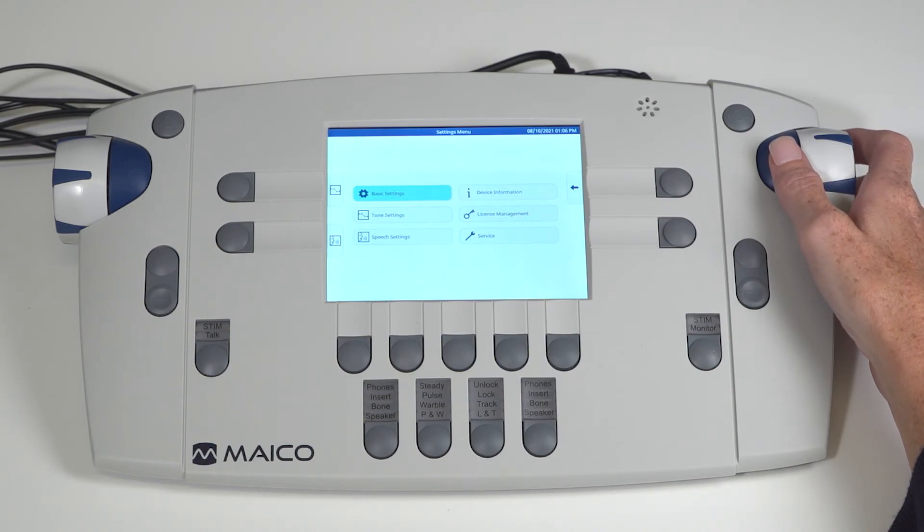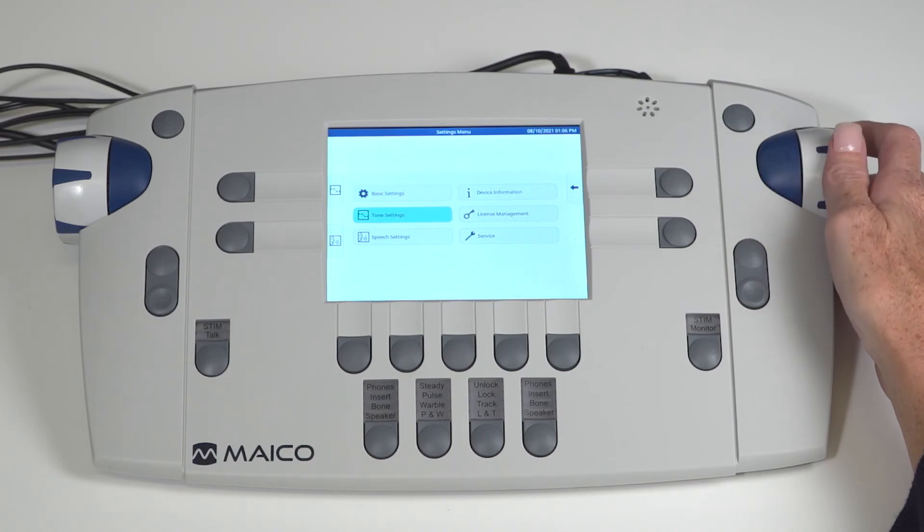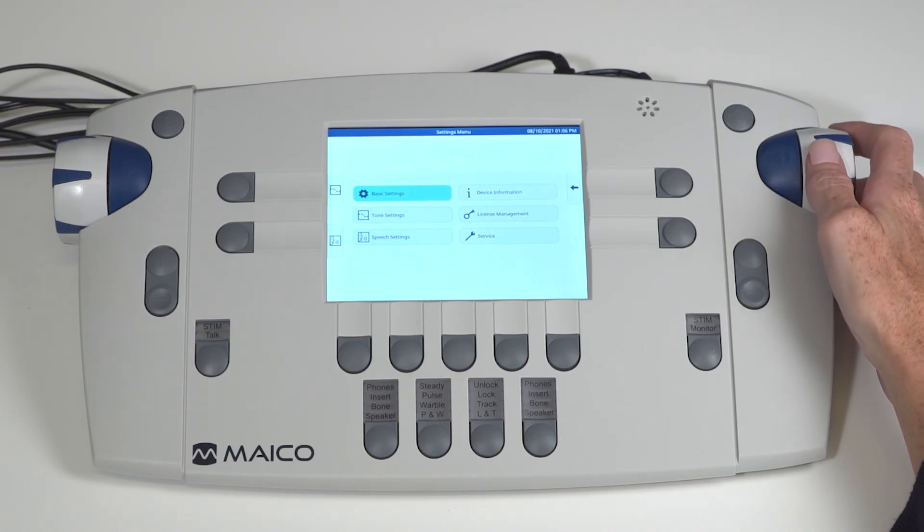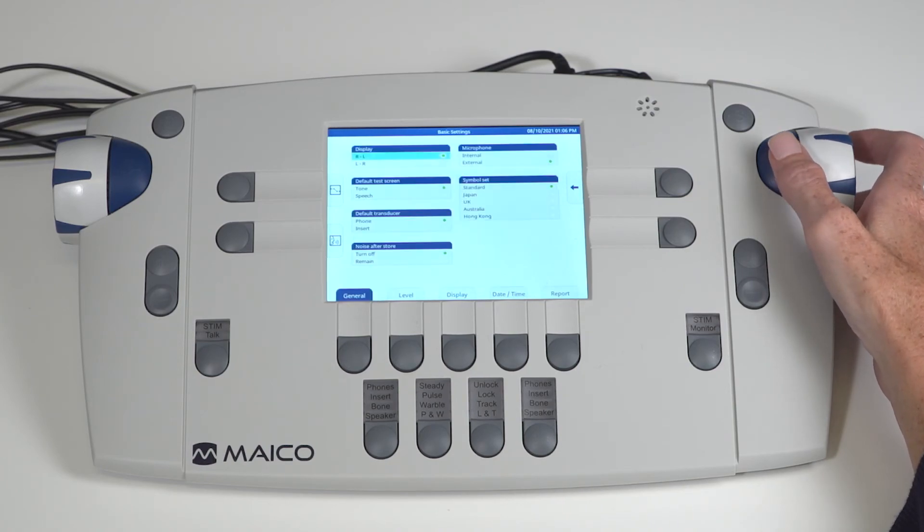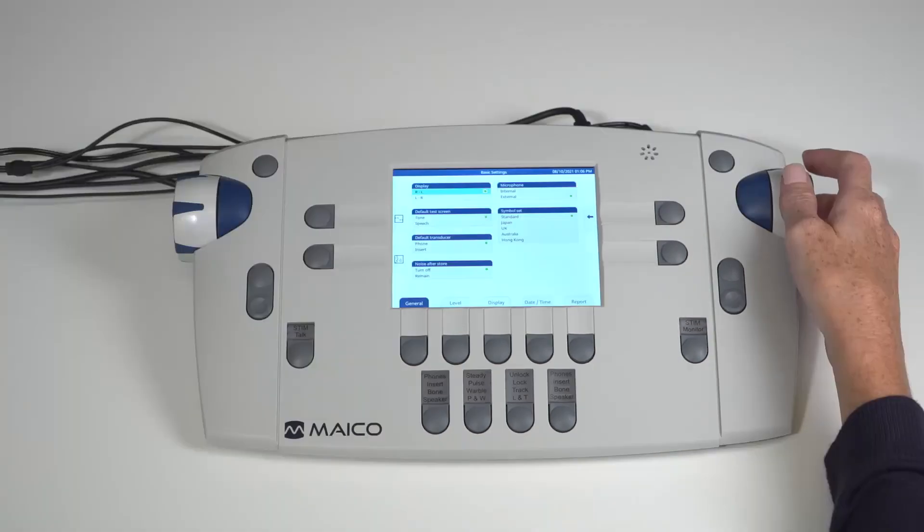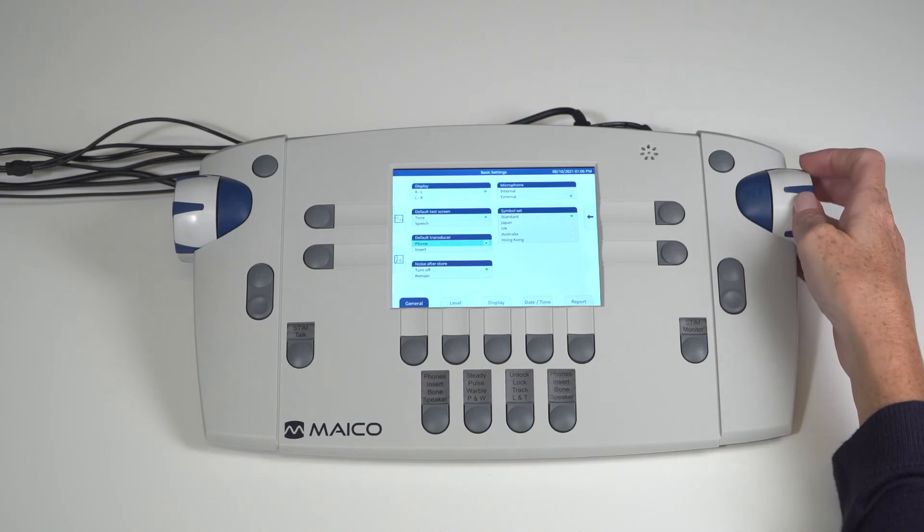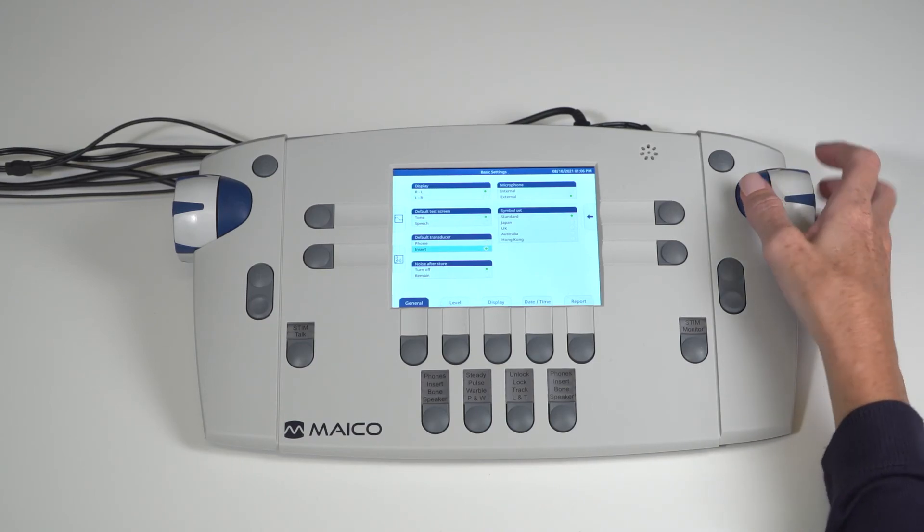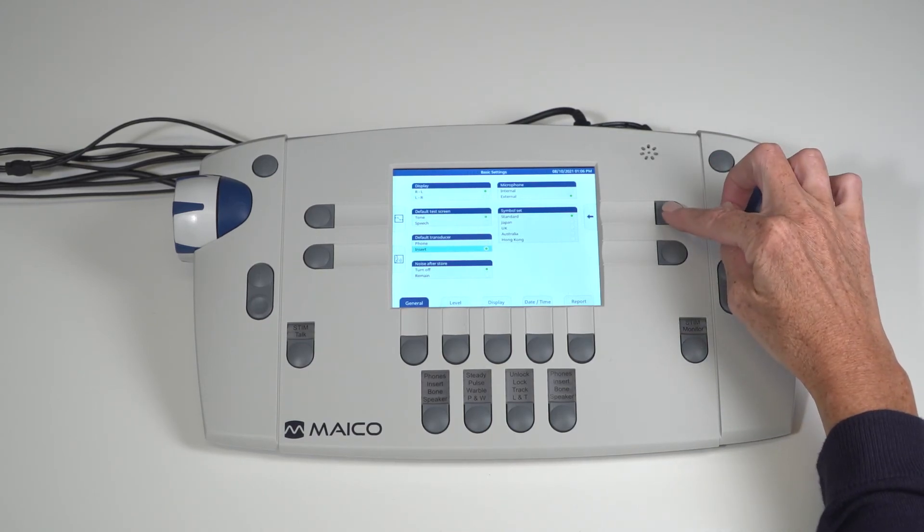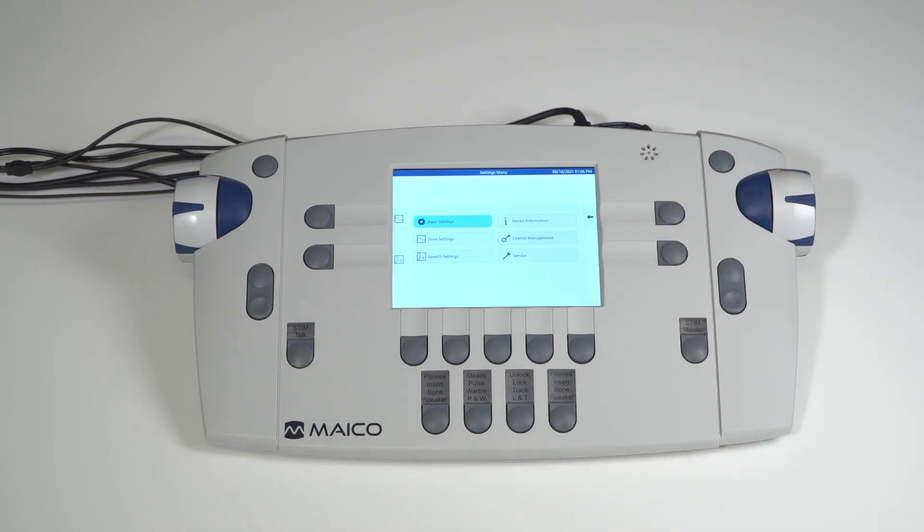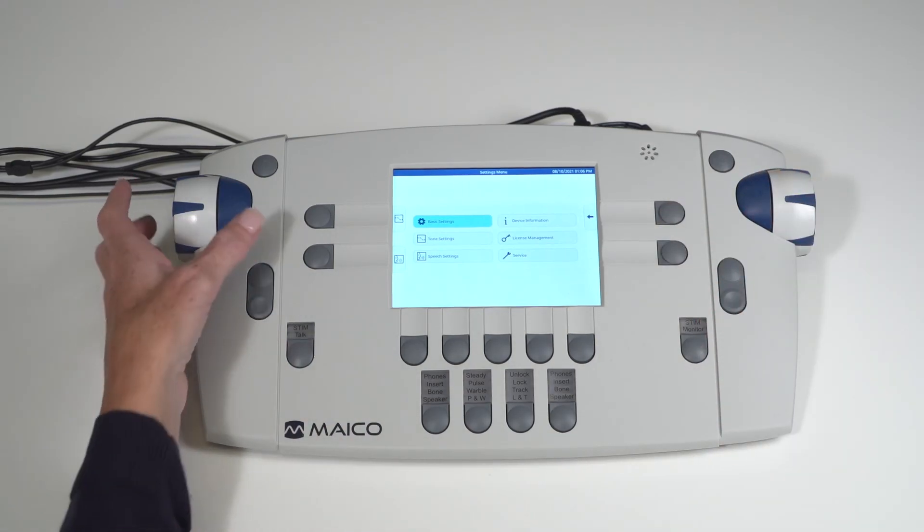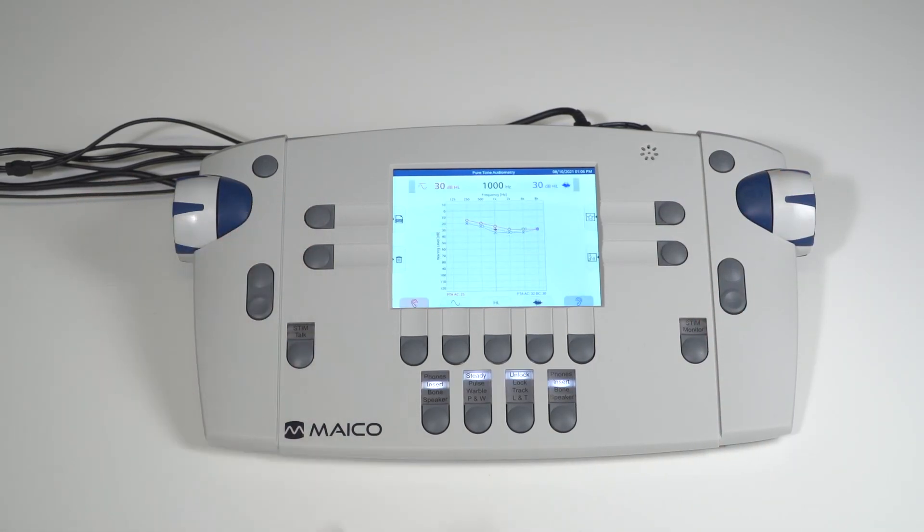Once in the setting menu, options are managed through multiple categories. Use the side dial to scroll through the selections and the present key to access the setting options. When changes to settings are made, they are immediately saved. Use the back key to return to the previous screen or for immediate exit of the menu, use the tone or speech keys on the left side of the display screen.